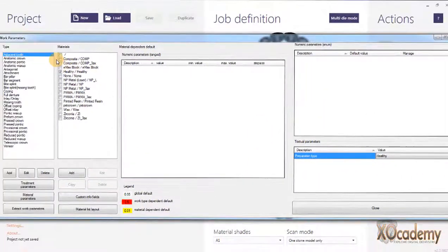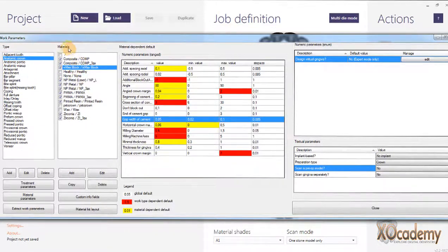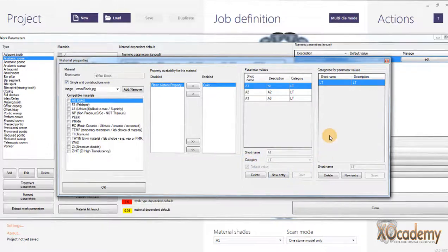You start that program, and now you can see for an anatomic crown I have a new material. I just click Add, I've named it 'eMax Block,' and I've put in all my settings. Right here, 'Image' is where you can add that image. You can also add shades — I have low translucency blocks, and A1, A2, A3.